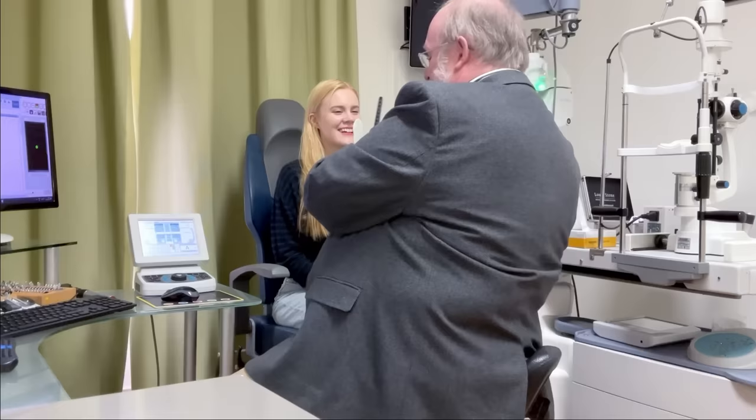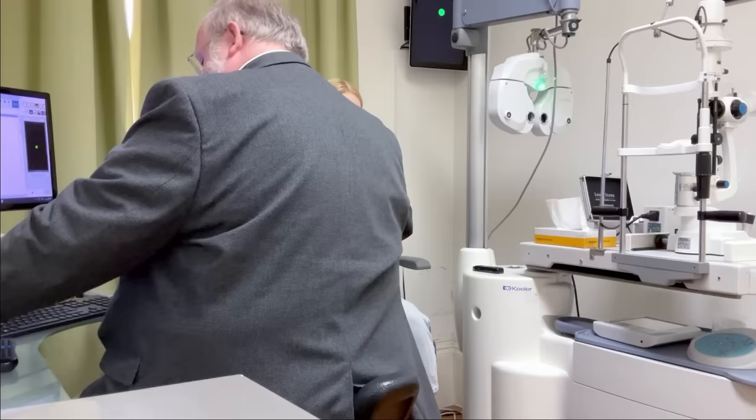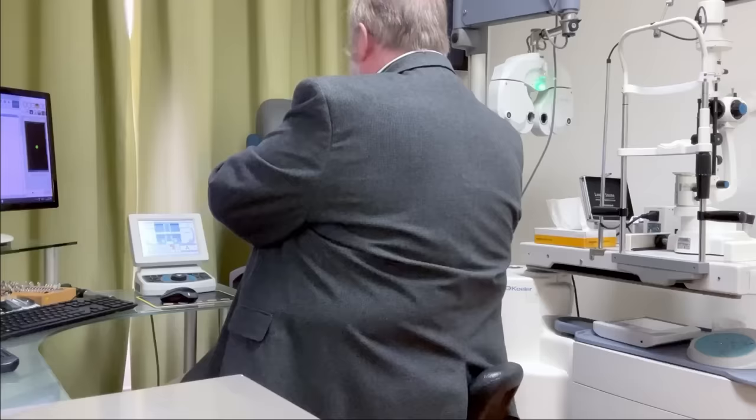I'm going to make you cross-eyed with this one. Watch it coming in. Watch it coming in. Watch it. Okay, well done. You can cross your eyes, can't you? Excellent. It's a bit strange, that one, isn't it? Makes your eyes go a bit funny. But that's good. Now, I'm just going to take a measurement.